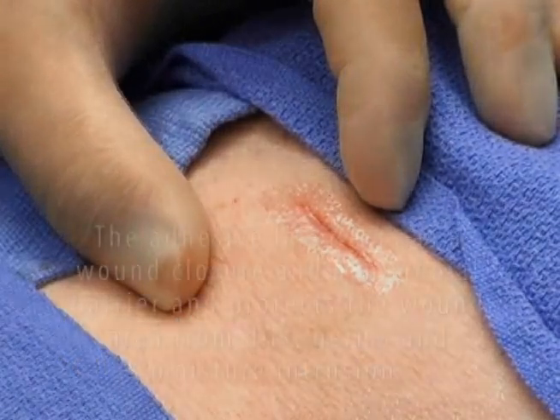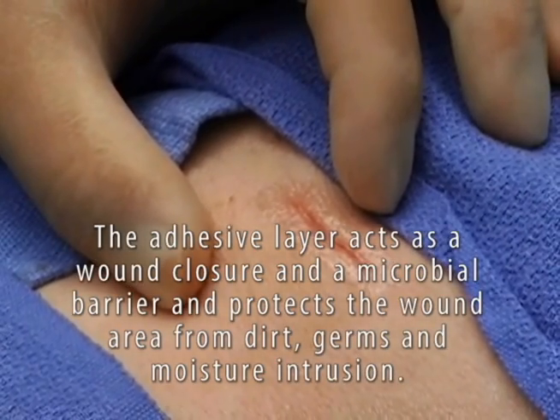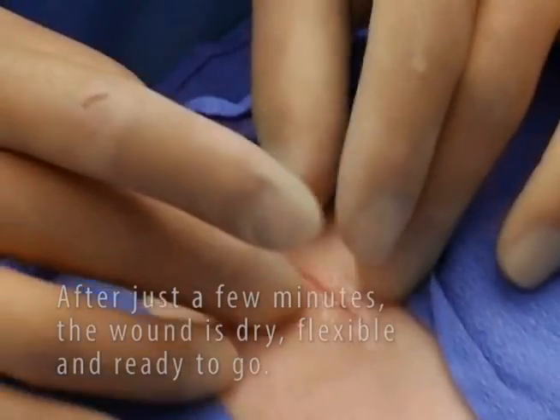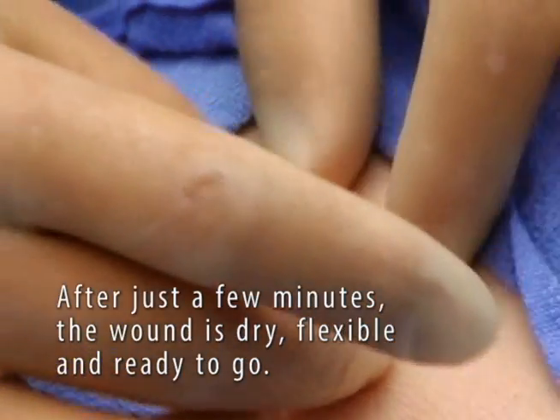The Dermaflex QS adhesive layer acts as a wound closure as well as a microbial barrier sealant, protecting the wound from dirt and germs. Returning to the wound just minutes after application, it is dry, completely flexible, and ready to go.